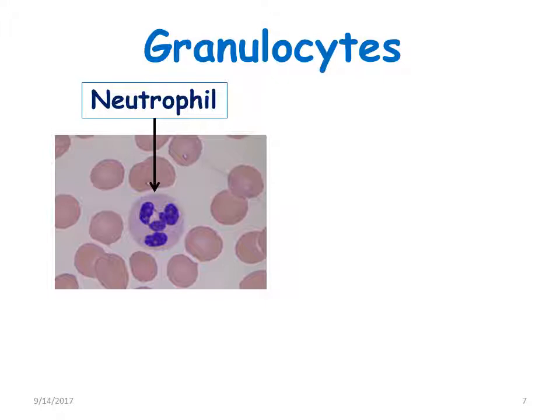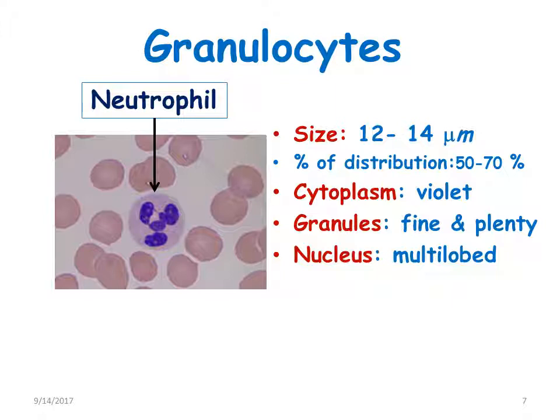Now let us look at each granulocyte individually. Neutrophils are around 12 to 14 micrometers in diameter, with a percentage distribution of 50 to 70%. The cytoplasm is violet in color. The granules are fine and plentiful, and the nucleus is multi-lobed.